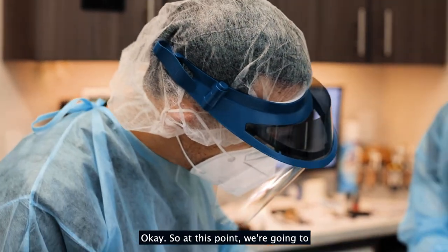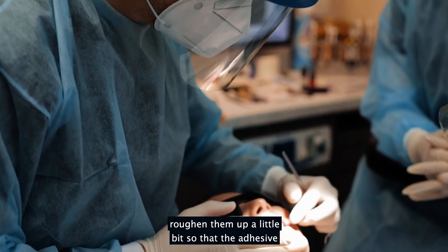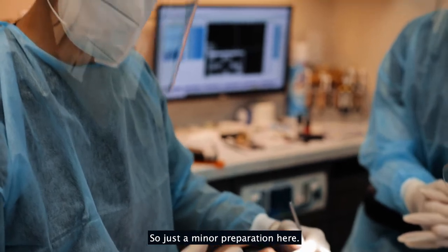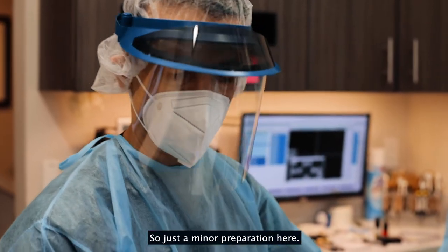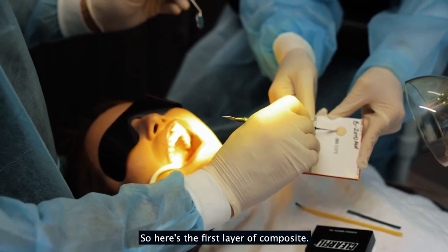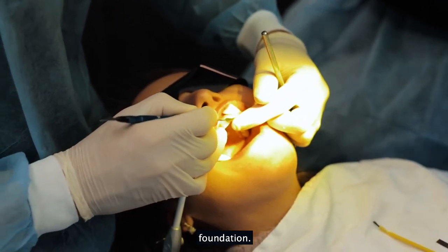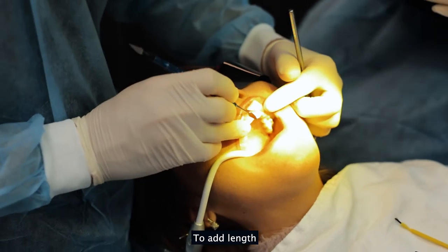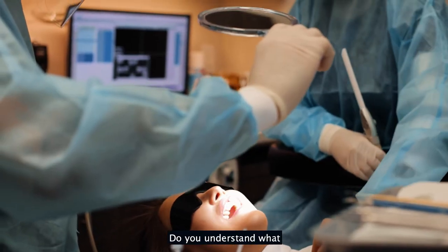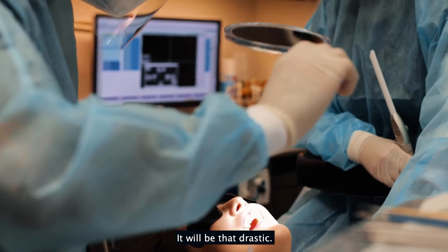At this point we're going to carefully roughen the teeth up a little bit so that the adhesive applies onto the teeth more retentively. So just a minor preparation here. Here's the first layer of composite that I'll use as a foundation to add length. You can see how drastic the change will be.